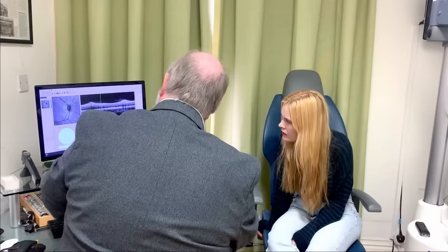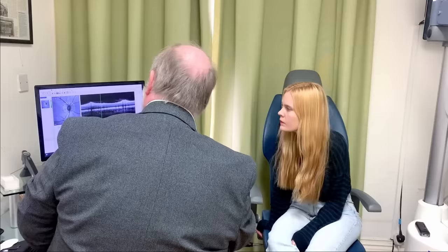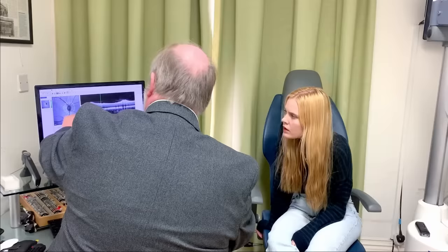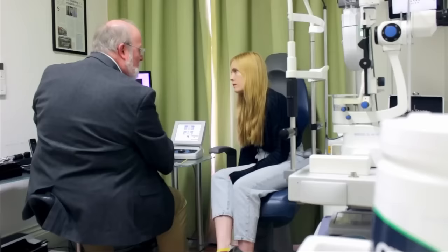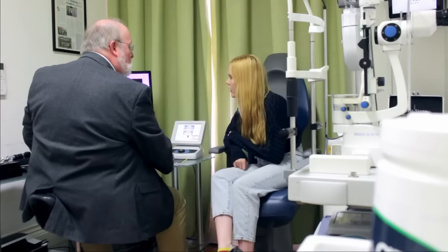We have different bundles. So the superior bundles are always a bit thicker, and the inferior ones a bit thicker, because those are the ones that do the major part of our vision for us. They do the very sharp part of our vision, okay? And they go to this area here, which is called the fovea. And we look at those for damage or loss of thickness. And this can indicate something called glaucoma, okay? But as you can see, yours are nicely within the green statistical range, you're okay. So that looks very good.